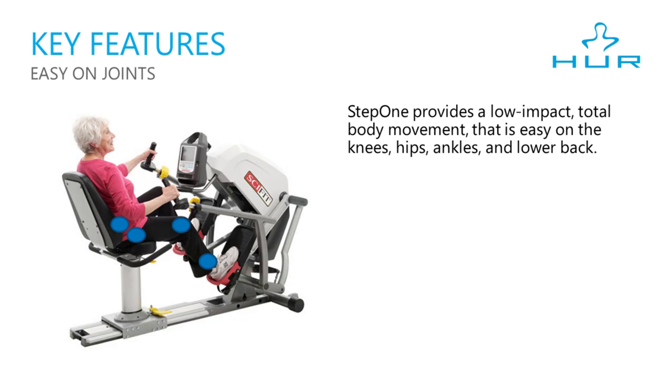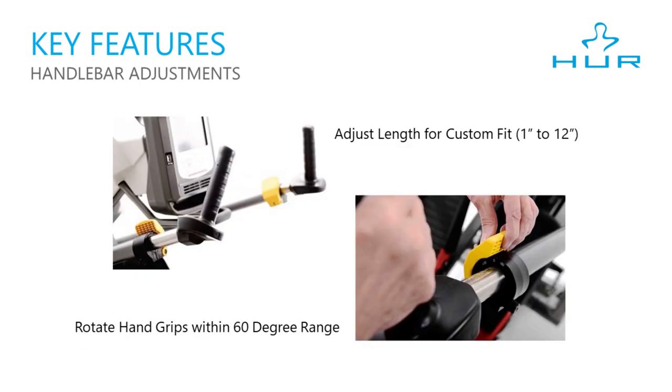The Step 1's low impact total body movement is easy on the knees, hips, ankles, and lower back joints. The handlebars have a few adjustments that allow a good fit for any user. Arm links adjust from 1 to 12 inches and the hand grips can be positioned within a 60 degree range. The yellow paddle adjustments are large and easy to pull, which is great for someone with gripping challenges.